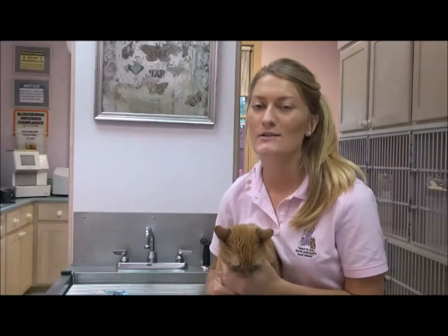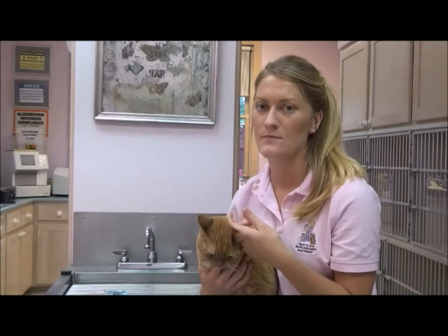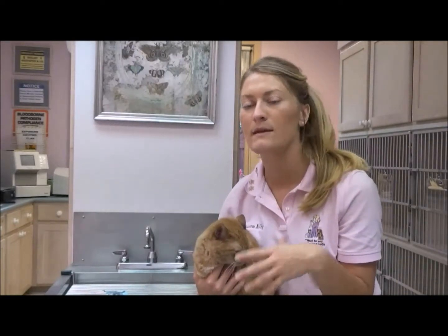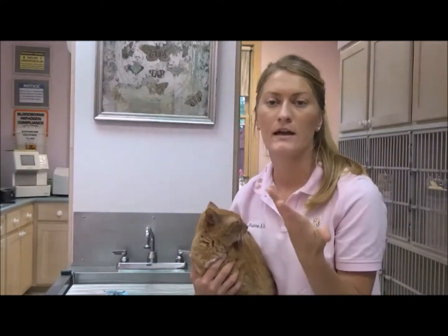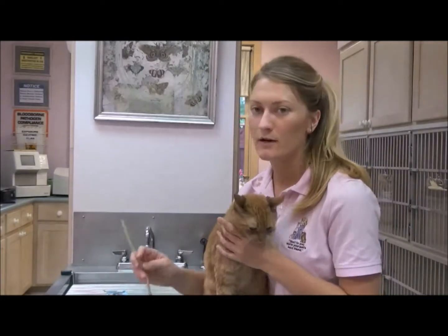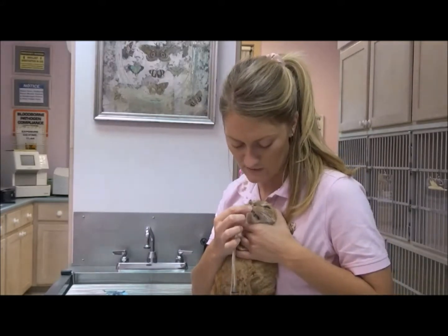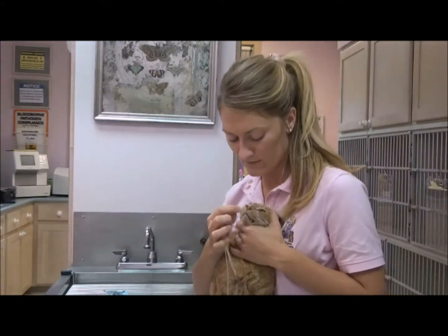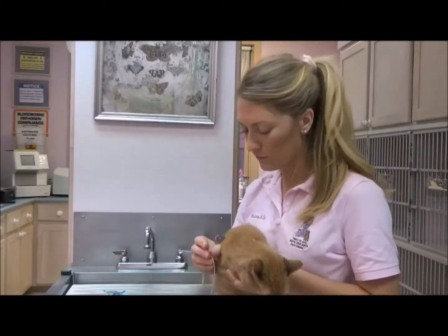When selecting an endotracheal tube for a patient, it's always best to have about 3 options prepared and ready. There are a few different ways you can tell what tube would fit your patient. Number 1, you can always reference an endotracheal tube chart, which will give you ideas based on the patient's body size, what tube might work best for them, or based on their breed. Another way to tell is to take a tube and measure the tip of it between their nostrils. The tube should be about the same size as the distance between those nostrils. So far it's looking like Penny's a size 4.